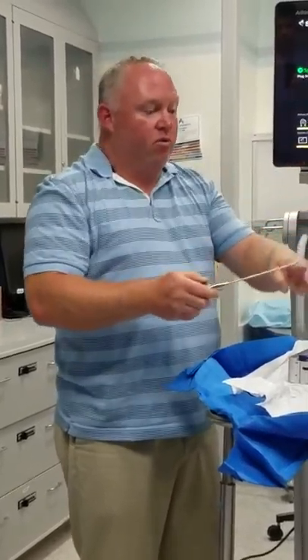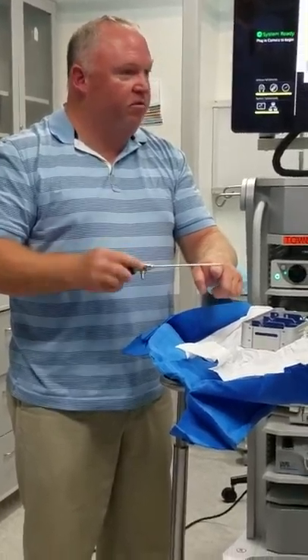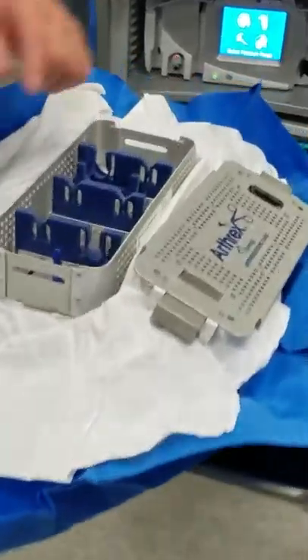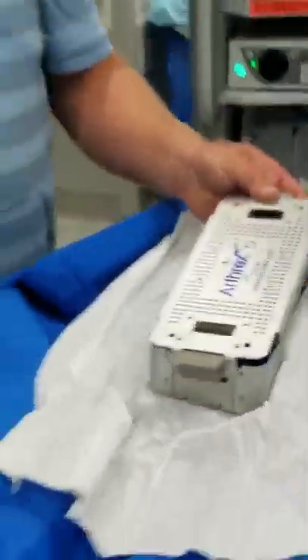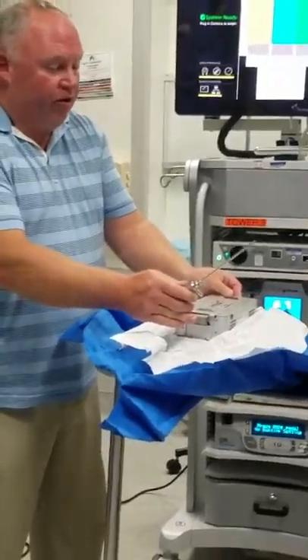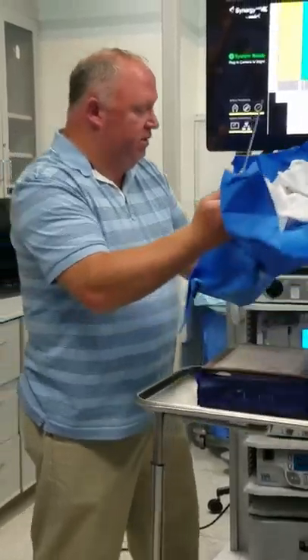So it allows you to look down, look up, look to the side, without even moving your scope around. That's why you do that, okay? So you can see around a corner, believe it or not, too. So it's called a scope. So 70 degree scope. You have 70, 30, and 0. Most commonly, you're going to use a 70 or a 30. We're going to start with a 70 most commonly. Not always, but most commonly.